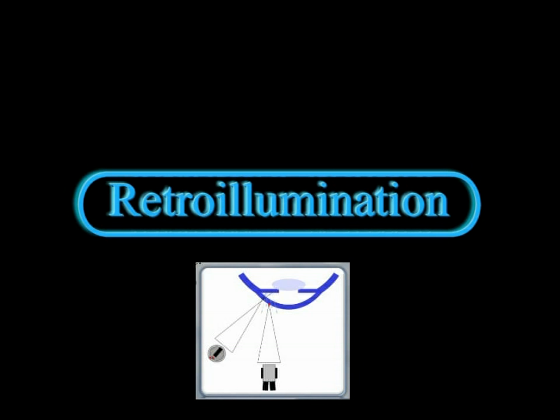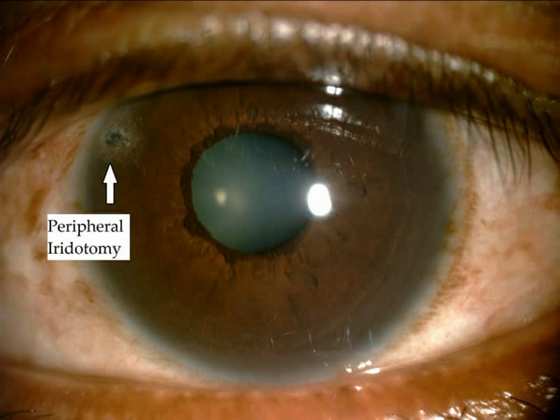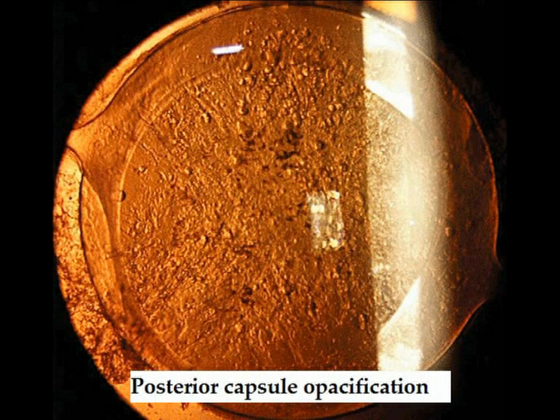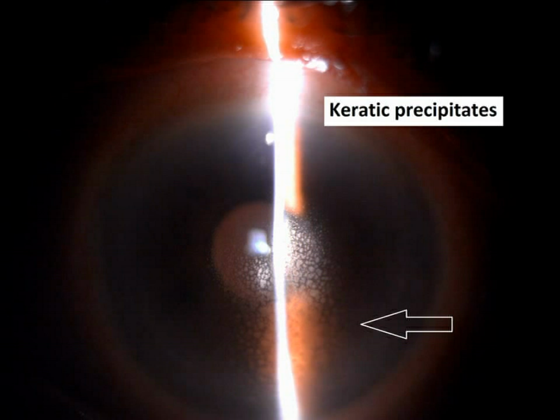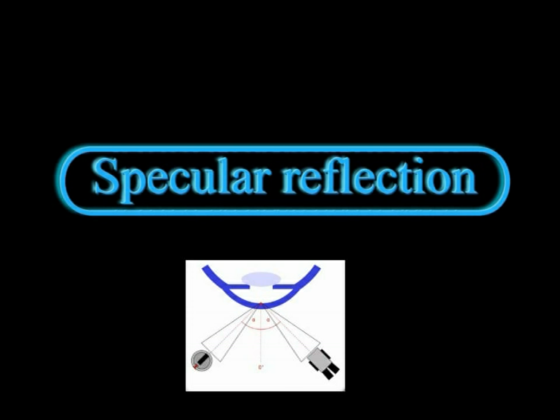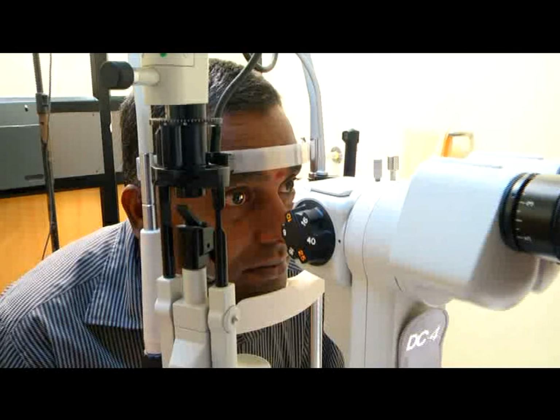Another method of indirect viewing is retroillumination. It is used to look for the patency of peripheral iridotomy, posterior polar cataract, posterior capsular opacification, keratic precipitates, retroillumination of the cornea showing a foreign body. Moving on to the specular reflection, magnification and moderate broad beam is used to examine the anterior surface like the precorneal tear film, and with higher magnification, endothelial guttae can be appreciated.